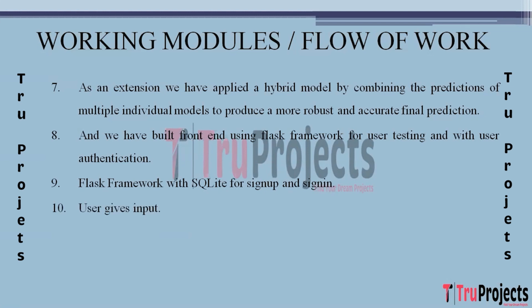So after signing in, users provide input through the front-end interface. The input data is pre-processed to prepare it for prediction by the trained models. This pre-processing step ensures that user-provided data is in a suitable format for the model.